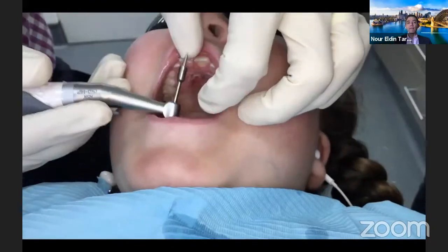And this is my daughter. Both of my daughters actually happen to have a class 3 malocclusion. So Hannah got her TADs in. She was 8.5 at the time.